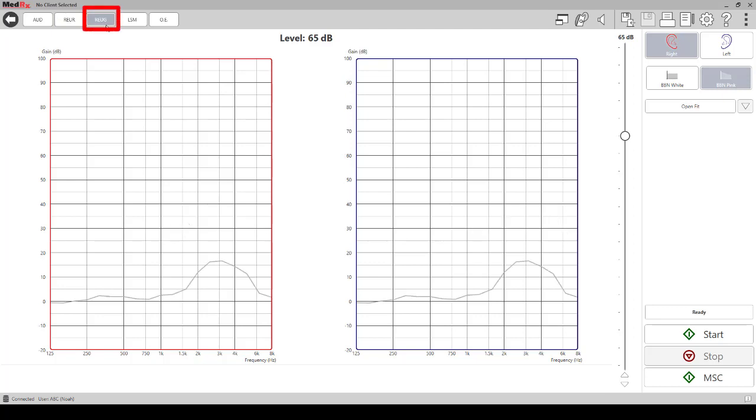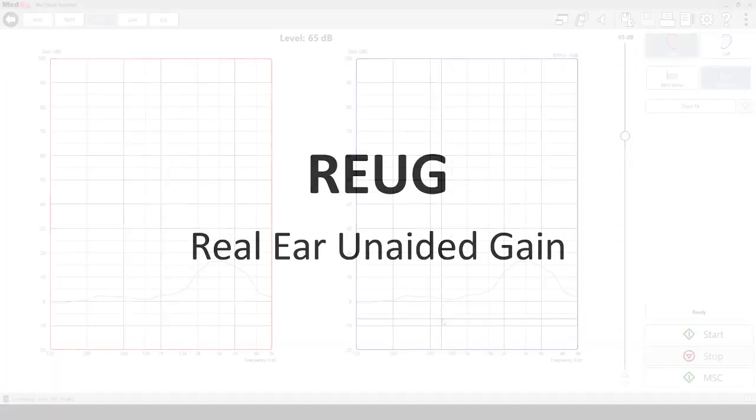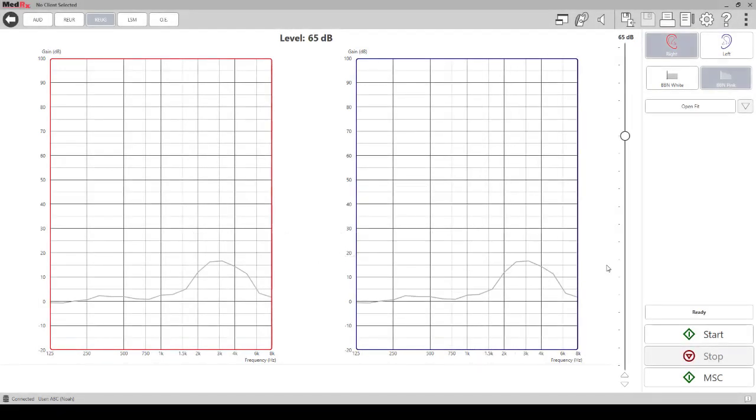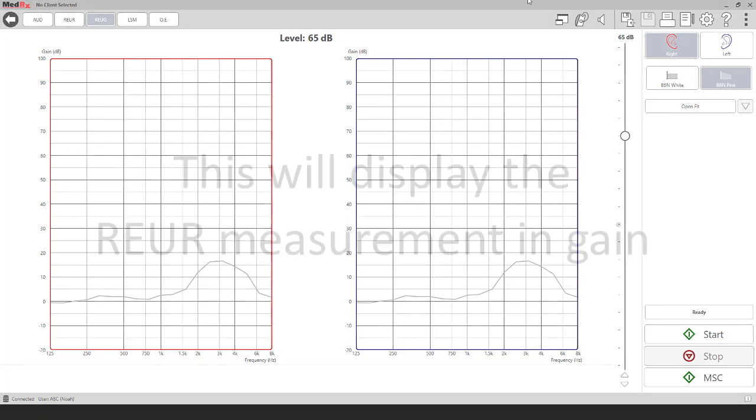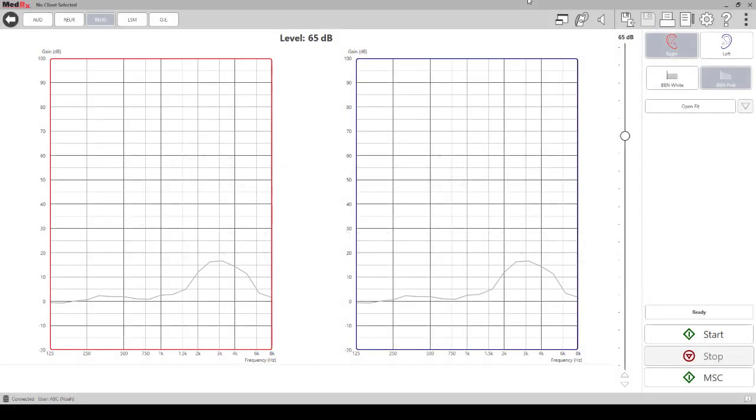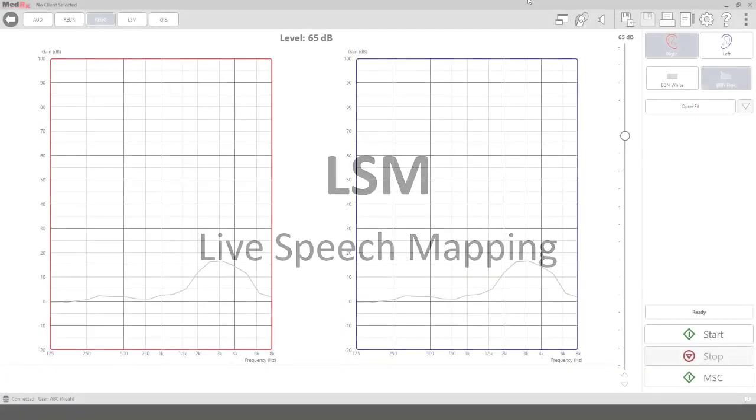REUG - Real Ear Unaided Gain. You can run or view the results in gain by selecting the real ear unaided gain tab or REUG. This will display the REUR measurement in gain. The measurement takes into account the patient's real ear characteristics and displays it and compares to KEMAR. LSM or Live Speech Mapping measurements will be performed in this tab.